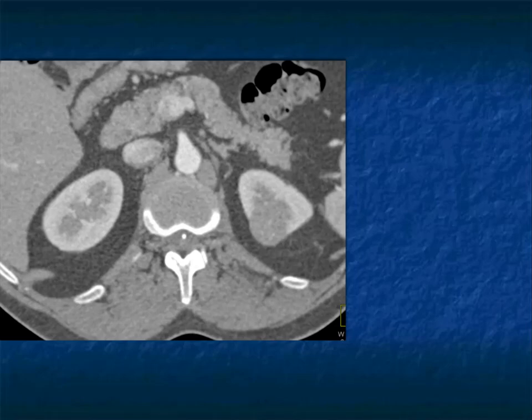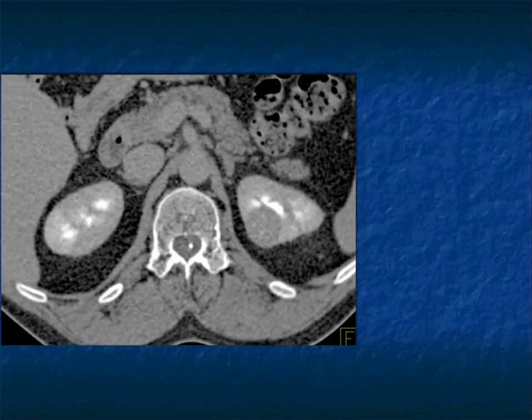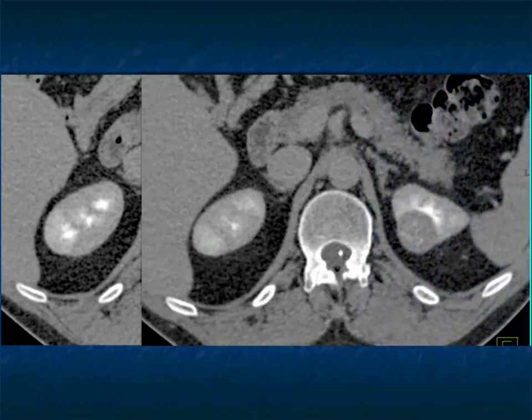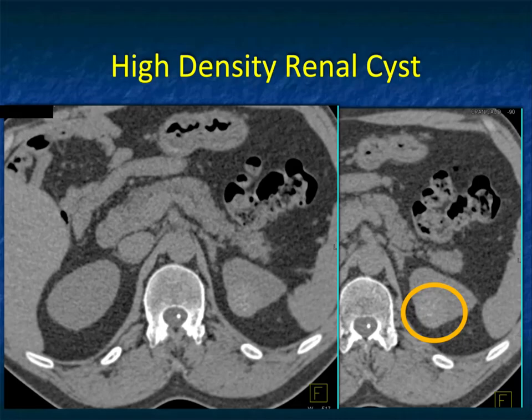Another example — a mass in the left kidney. First you'd say solid mass, well-defined, likely papillary renal cell carcinoma, maybe with faint calcifications. Looking only at the excretory phase, you'd say solid tumor, papillary. But if you compare the two phases, the attenuation did not change, and this is the classic appearance of a high-density renal cyst.